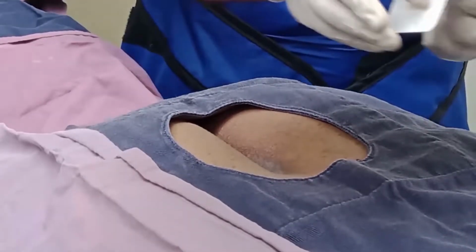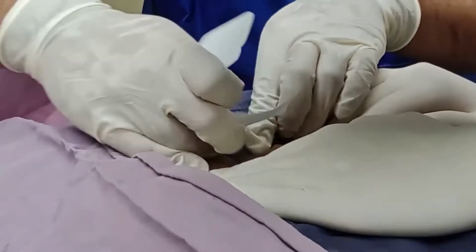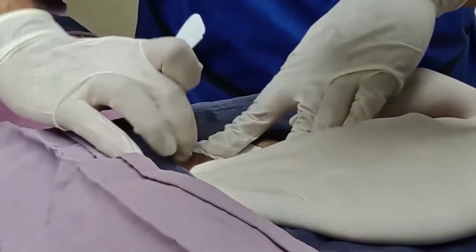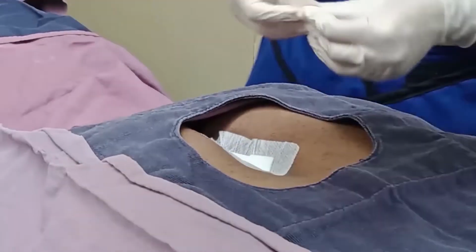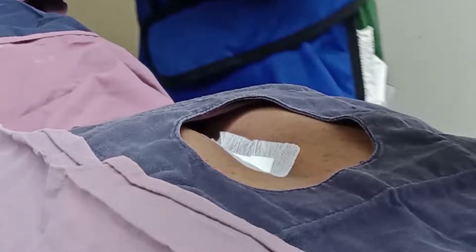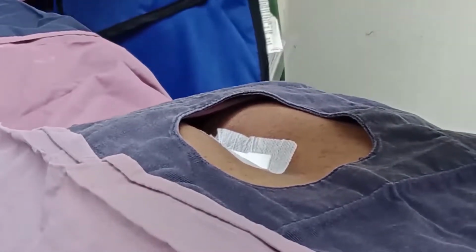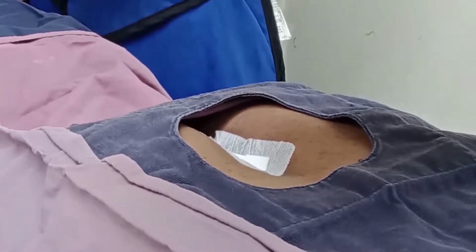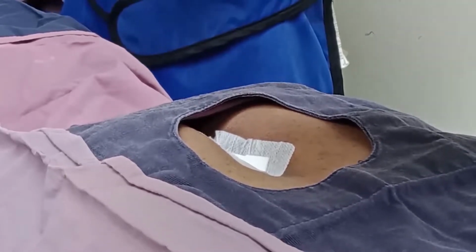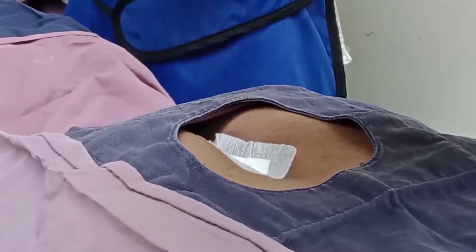The procedure is finished, and afterwards the patient will be kept supine for 15 to 20 minutes in the post-operative recovery unit, where the patient is monitored for saturations, heart rate, and blood pressure. Before the patient is discharged, he is again seen by the pain interventionist to ensure that there is no motor block and the legs are working well.